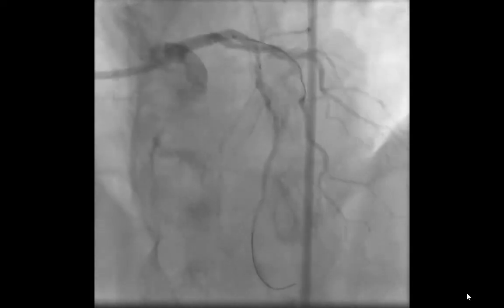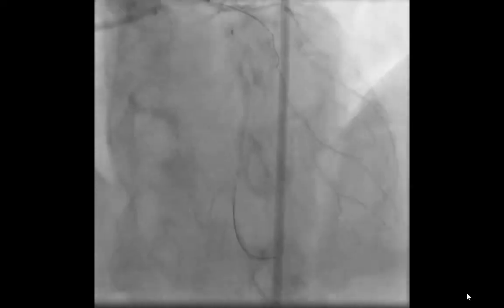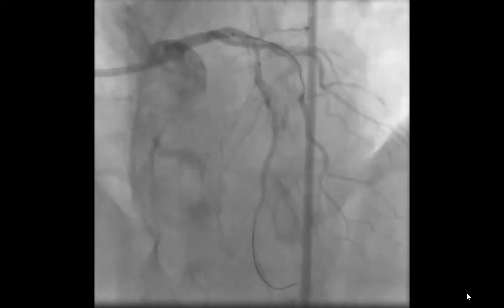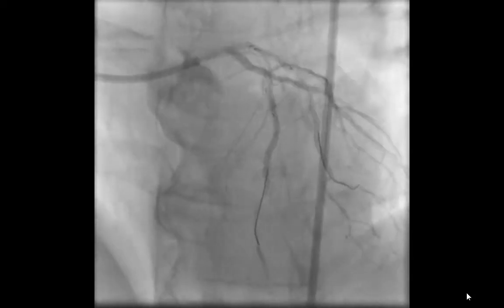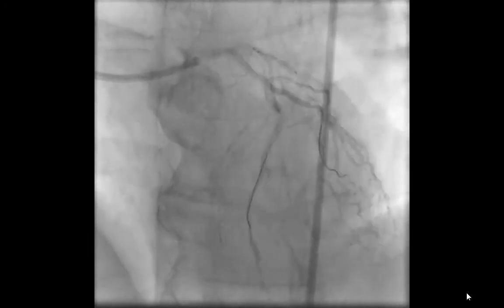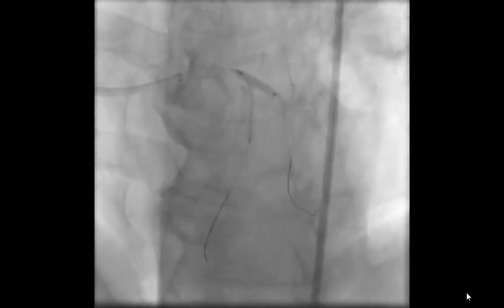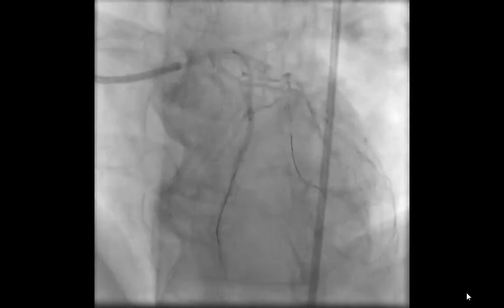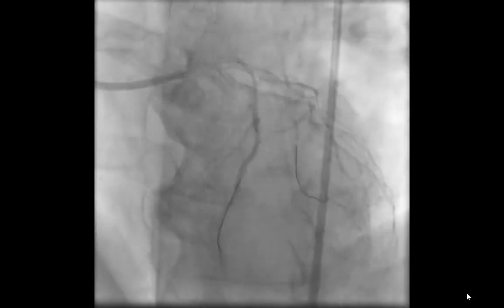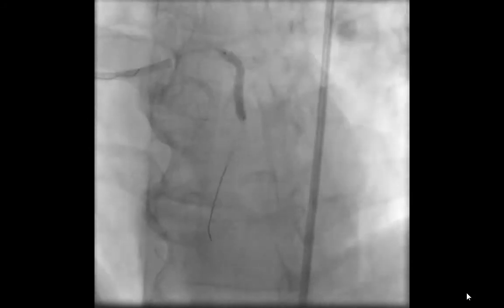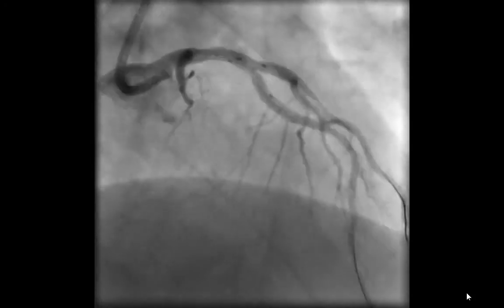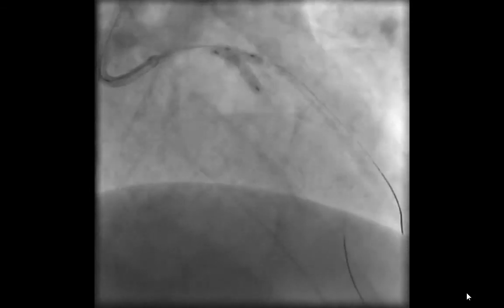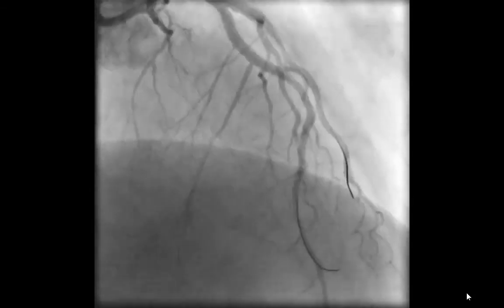Ballooning of the LAD was performed with re-establishment of flow. Now we're faced with the dilemma of managing a bifurcation lesion at a proximal LAD and a large diagonal. The choice strategy here was to perform a crush stenting technique, where the diagonal stent was deployed, and the diagonal balloon and wire were removed after ensuring no further dissection of the diagonal. Then the LAD stent was deployed, crushing the diagonal stent. Recrossing of the diagonal wire and finishing with a kissing balloon was performed with excellent angiographic results and TIMI-3 flow in both branches.